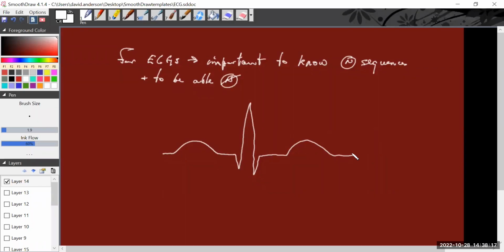The ECGs that I've showed you in this presentation could be included in a question, but I would ask you questions in such a way as that you would be able to start to look at it and figure out what it is I'm talking about. So if we see atrial contractions in between ventricular ones, you're thinking about atrial flutter or fibrillation.